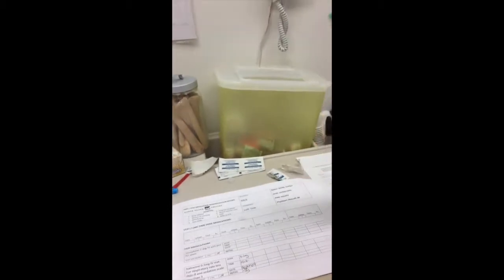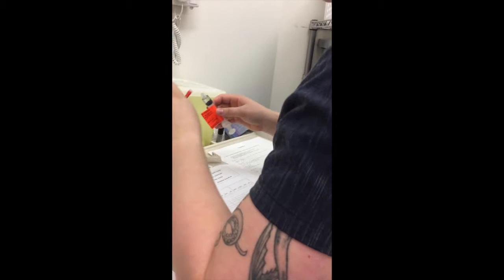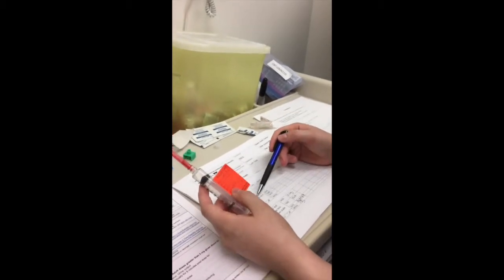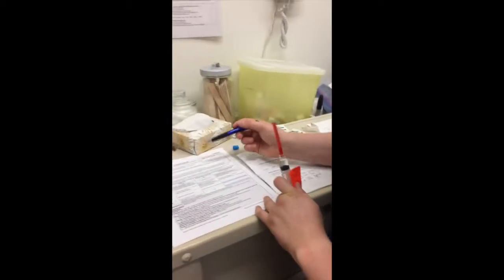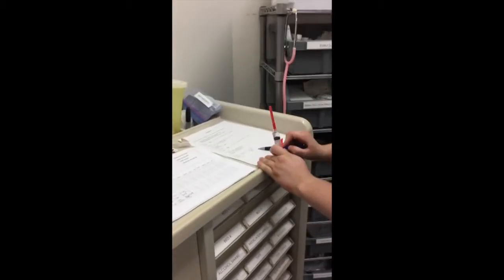Okay, perfect. So now I'm going to get a sterile syringe or needle to just put on top here to make sure that that is going to be safe. So now my final check. So this is for Evelyn Smith. It's morphine, it's going to be 2 milligrams, which is 2 mils according to my math, given every 1 hour IV as needed for pain. She hasn't had a dose yet. Evelyn Smith, no known allergies. Again, checking my monograph to make sure, since it's direct IV, we're going to be giving it 2 milligrams per minute. My math has worked that out to be 1 minute.